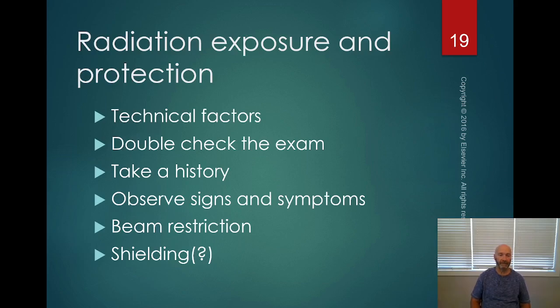Shielding still applies for you as a technologist. You have to wear your lead apron. But there's a lot of, and the reason I put this in parentheses with a question mark is because there's a lot of debate whether or not shielding should be used for the patient. And I think that the industry standard is going more towards not using shielding.